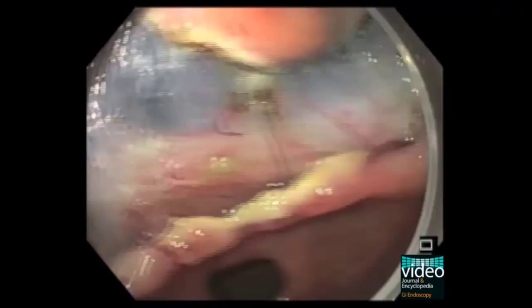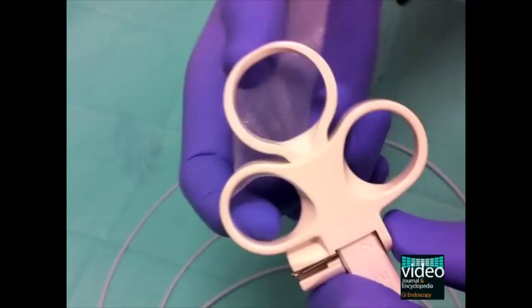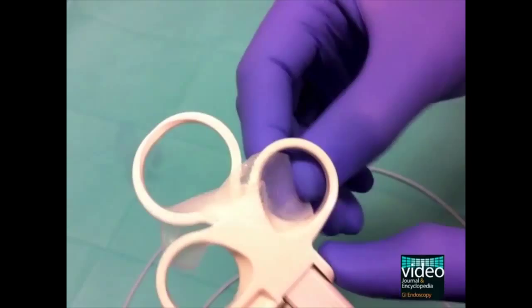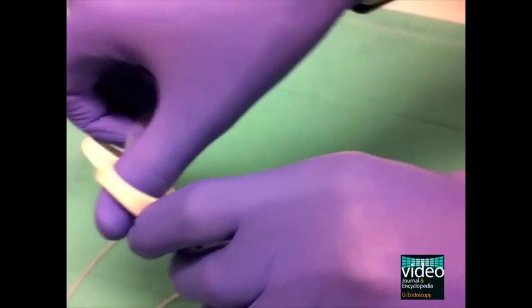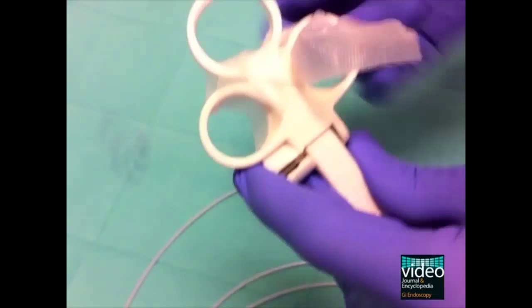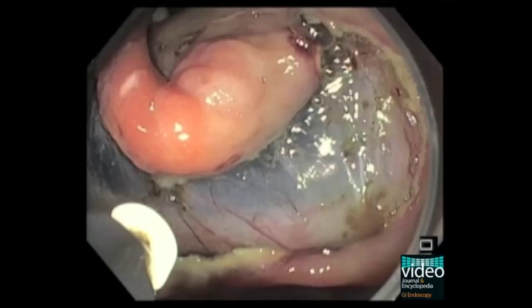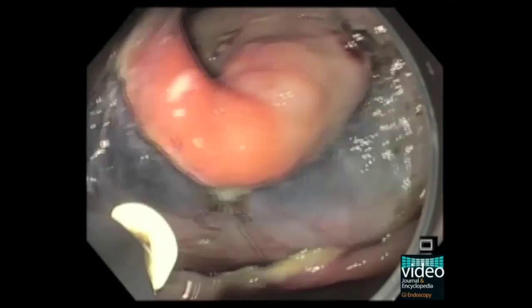A tape is used to block the snare handle. In this way there is no need for an additional operator to control the snare movements. By pulling the snare, the lesion is pulled, uncovering the submucosal space and the dissection plane, turning ESD faster and safer.